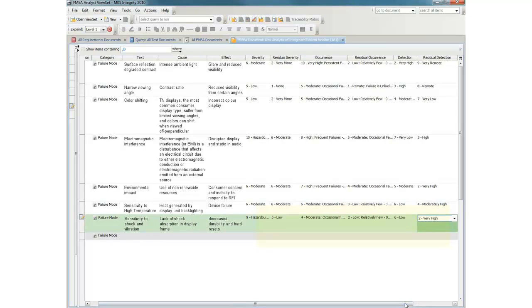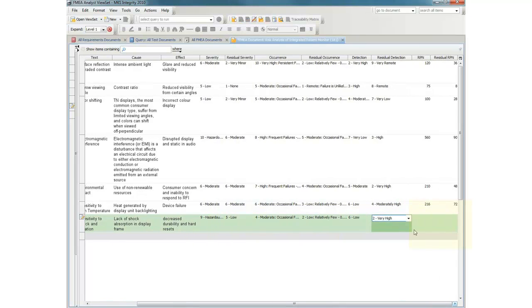Initial and residual risk priority numbers, or RPNs, are automatically calculated.